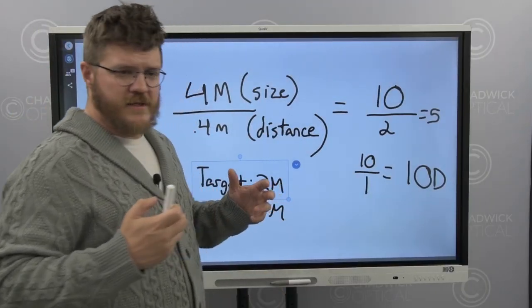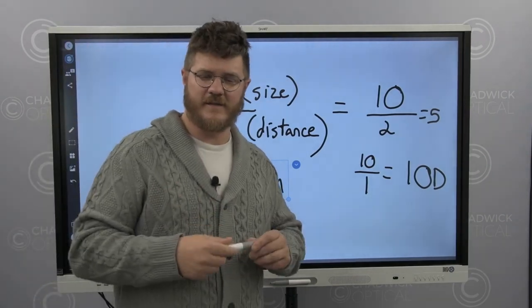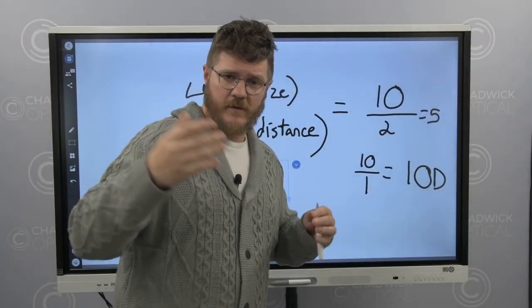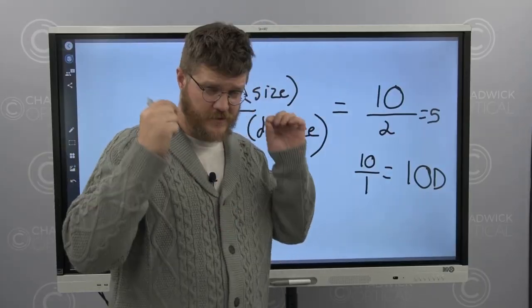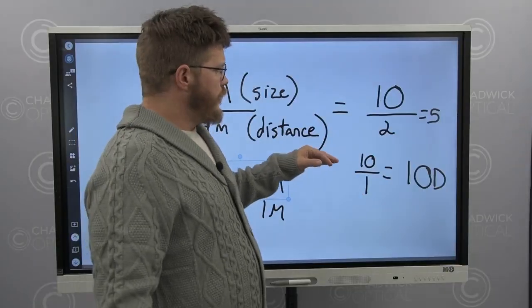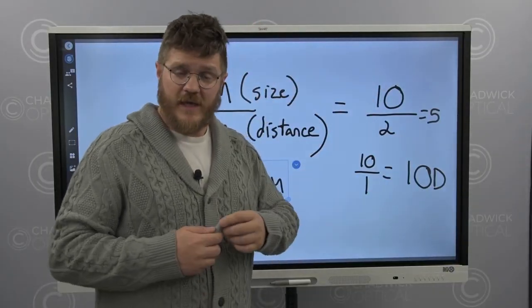Now this is a guide. This is not like a refraction where they're focusing light very specifically on your eye and making sure that you have a clear image on your retina and it's super accurate. This is an approximation, because if you undercorrect yourself, you won't be able to read what you need to read, and that'll be way harder.